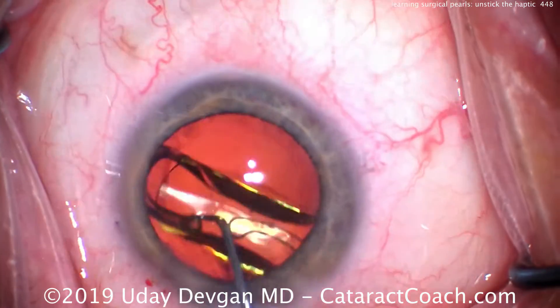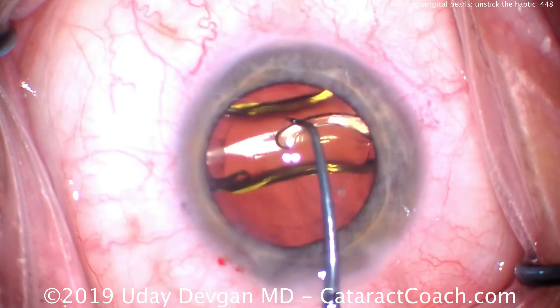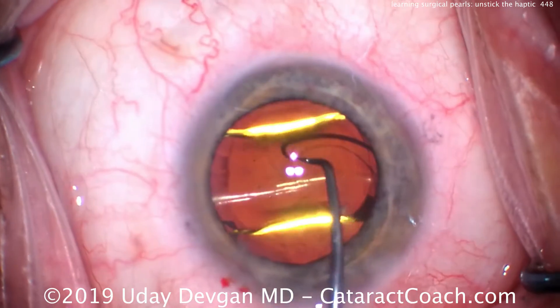We'll make sure it goes underneath the rhexis and put it in the desired orientation. A little bit of nudging on the haptics and they open up — a little sticky on the one, but just a couple more pushes and it's okay.